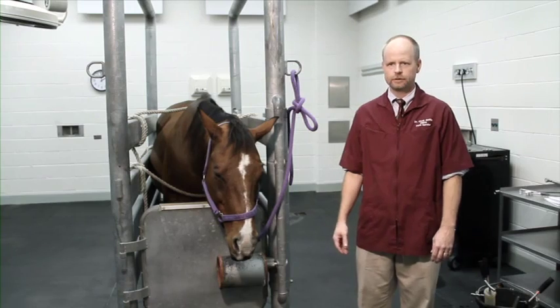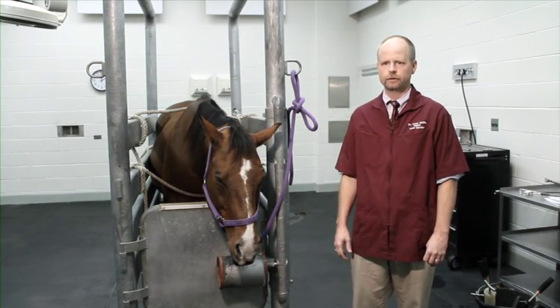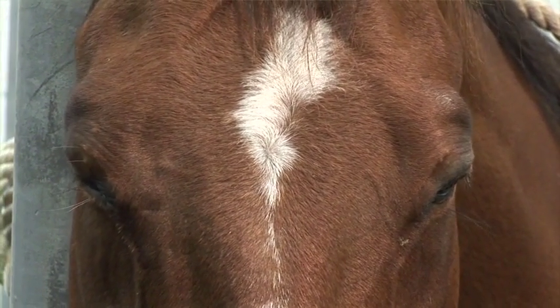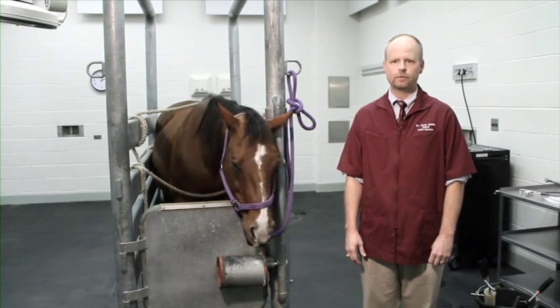For the purposes of this presentation, we did not film the entire dental procedure for Aggie, but we've taken care of all of her dental arcades and everything looks good. We took great care to minimize trauma to the oral soft tissues and the teeth, and with any dental case we want to avoid unnecessary complications such as excessive bleeding, infection, facial swelling, or pain. I'm Dr. Cleet Griffin, a diplomate of the American Board of Veterinary Practitioners, and I've enjoyed presenting this information about equine dentistry.